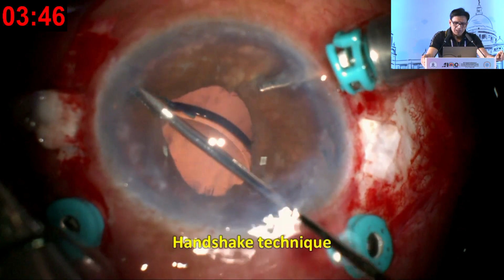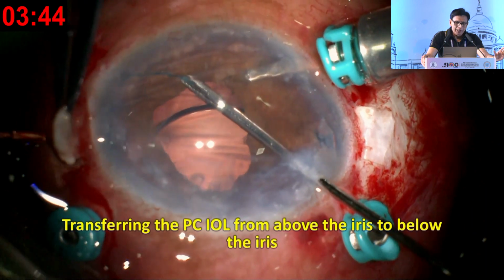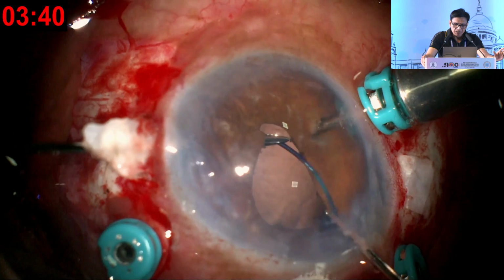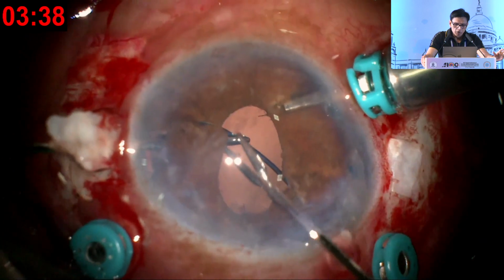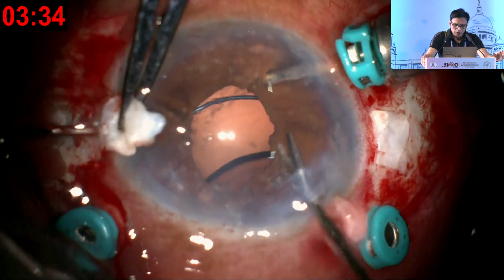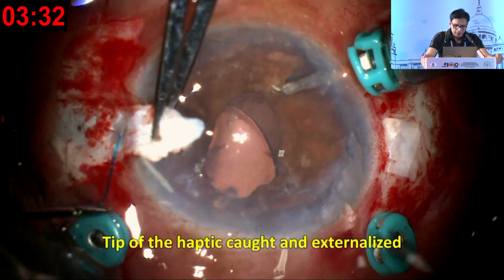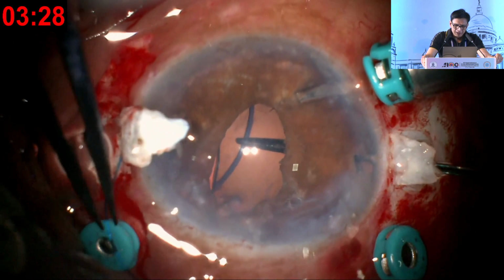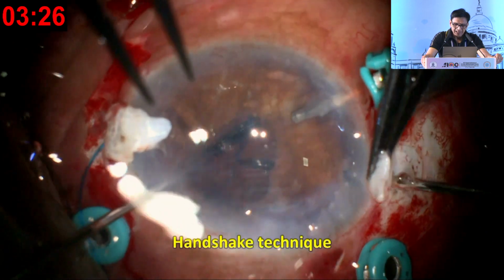Now the IOL is lying above the iris. So all I need to do is shift from above the iris to below the iris. And you see me doing that just now using the handshake technique. Here you can see from one hand to the other, catching the tip of the haptic and externalizing. Once the first haptic is out, I will do the same for the second haptic.